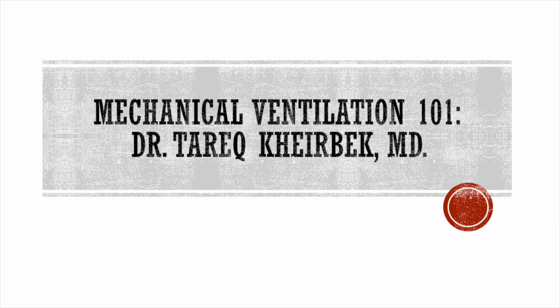Thanks for having me. Jumping right into it, Dr. Kheirbek, why do we put patients on positive pressure ventilation? You will see that patients are put on ventilation in the hospital in three settings, either in the emergency room, in the ICU, or in the operating room.